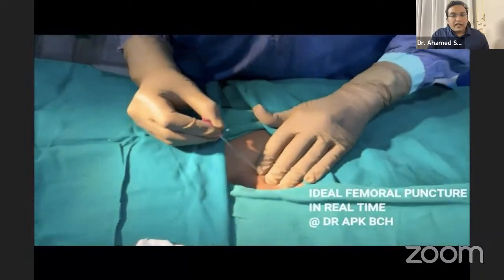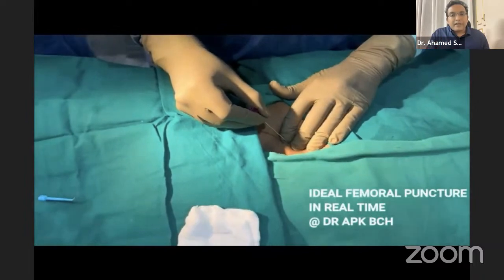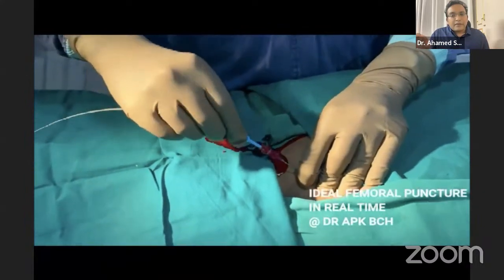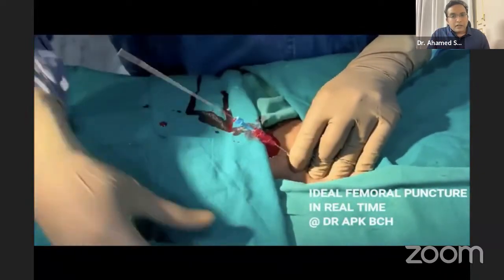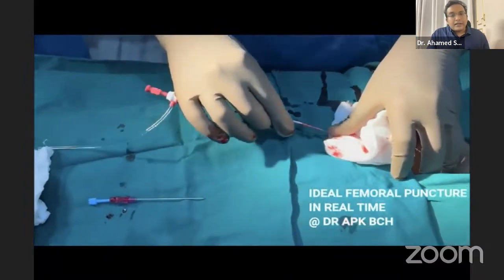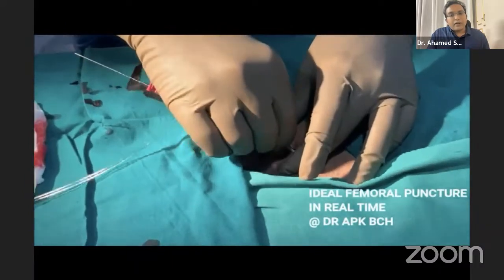So this is the ideal puncture, I would say. After palpating with the three finger method in the direction of the femoral artery, when we get the pulse, we put the needle at a 30 to 45 degree angle directed towards the umbilicus. After that we see the spurt of pulsatile blood coming in, and we insert the wire, a short J-tip wire. Keeping the needle in place, we then remove the needle, the wire stays inside, and we insert a 4 French femoral short sheath via a screwing technique, and we have now got the access.